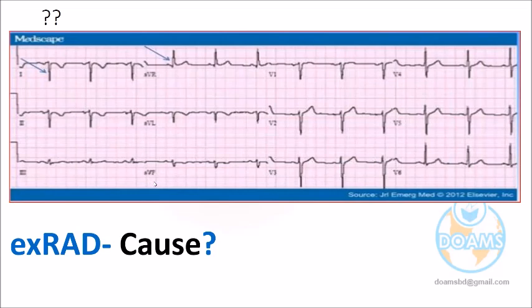If you look at the P wave in aVF, it is okay? Everybody please, it is a very important ECG in your practice. Is the P wave there? Yes. If the P wave is there, we cannot say that the heart apex is going up and base going down.